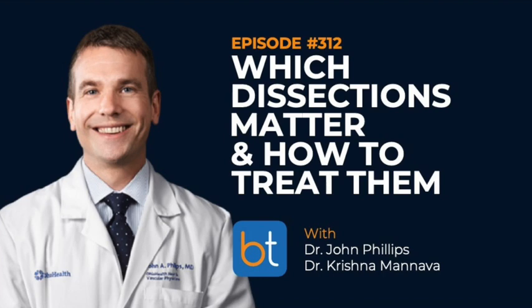Traditionally, we've used bare metal stents, sometimes covered stents, sometimes coronary stents below the groin. What makes TAC so different, just at a high level, for those of us who haven't used it or used it very little? What makes it so different than just a typical stent in the leg?